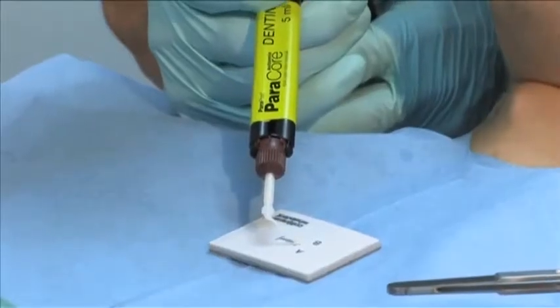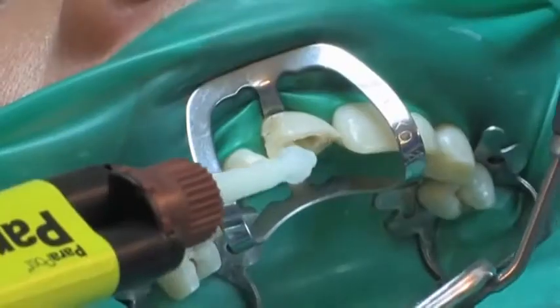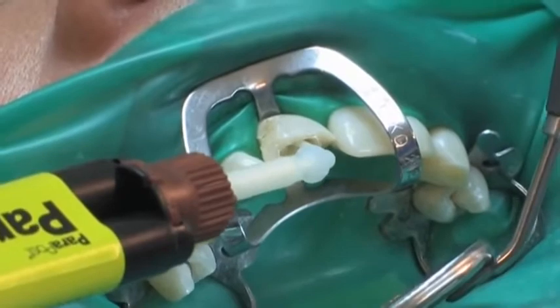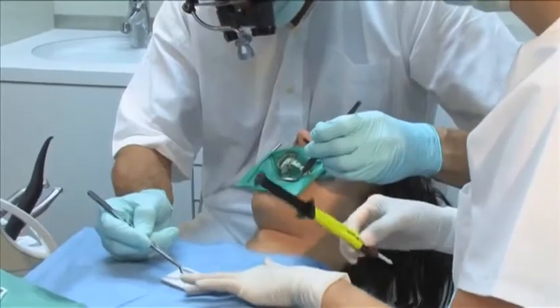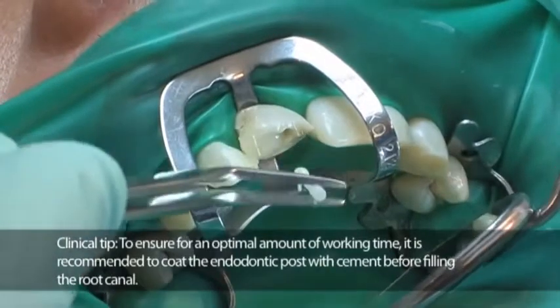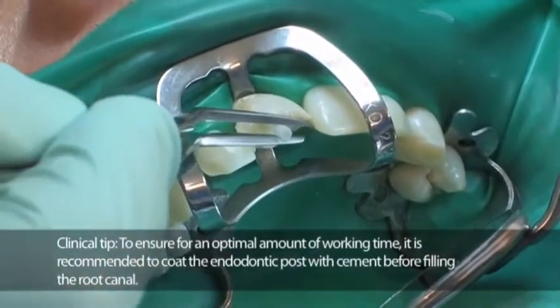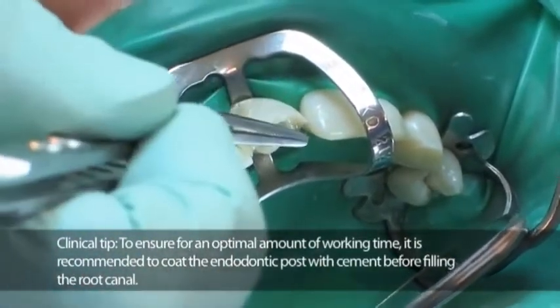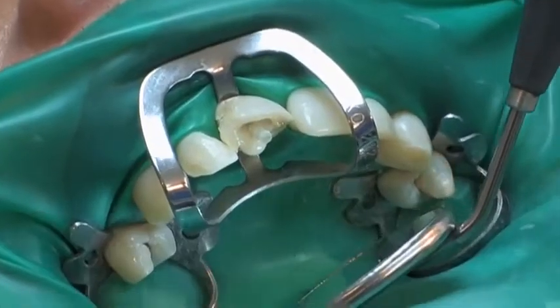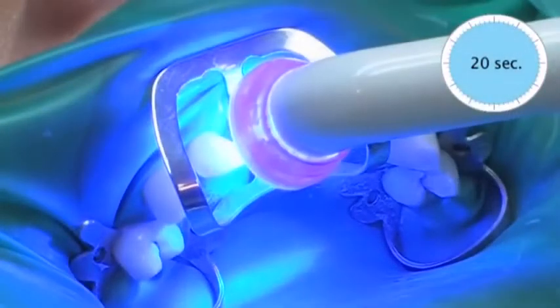The convenient curved root canal mixing tip allows Paracore to be applied directly into the root canal. The untreated post is coated with Paracore and cemented into the root canal. Since Paracore is dual cured, the curing light can be transmitted through the glass fiber post, reaching the Paracore material at the apex to accelerate the curing process.